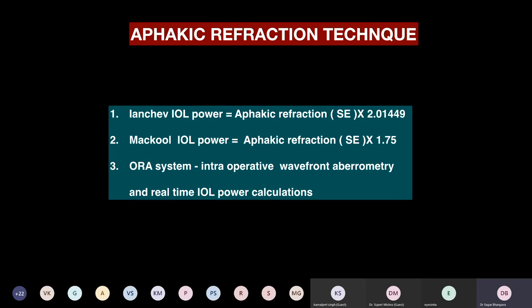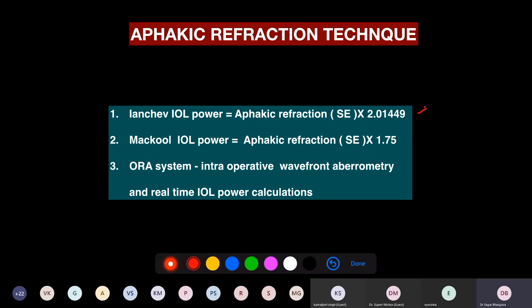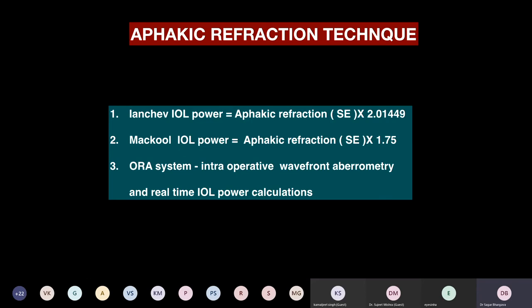So they do what is called the aphakic refraction technique, where the patient's cataract is removed and aphakic refraction is done either on the table or the patient is taken outside. Maybe after a couple of hours, the refraction is done and you either multiply it by a factor of 2 or by a factor of 1.75, and whatever value you get, that's your IOL power. Now, a new kid on the block is the ORA system, which basically does intraoperative wavefront aberrometry, and you get real-time IOL power calculation. Right now, it is still not fully accepted, but it is something that one can look at.